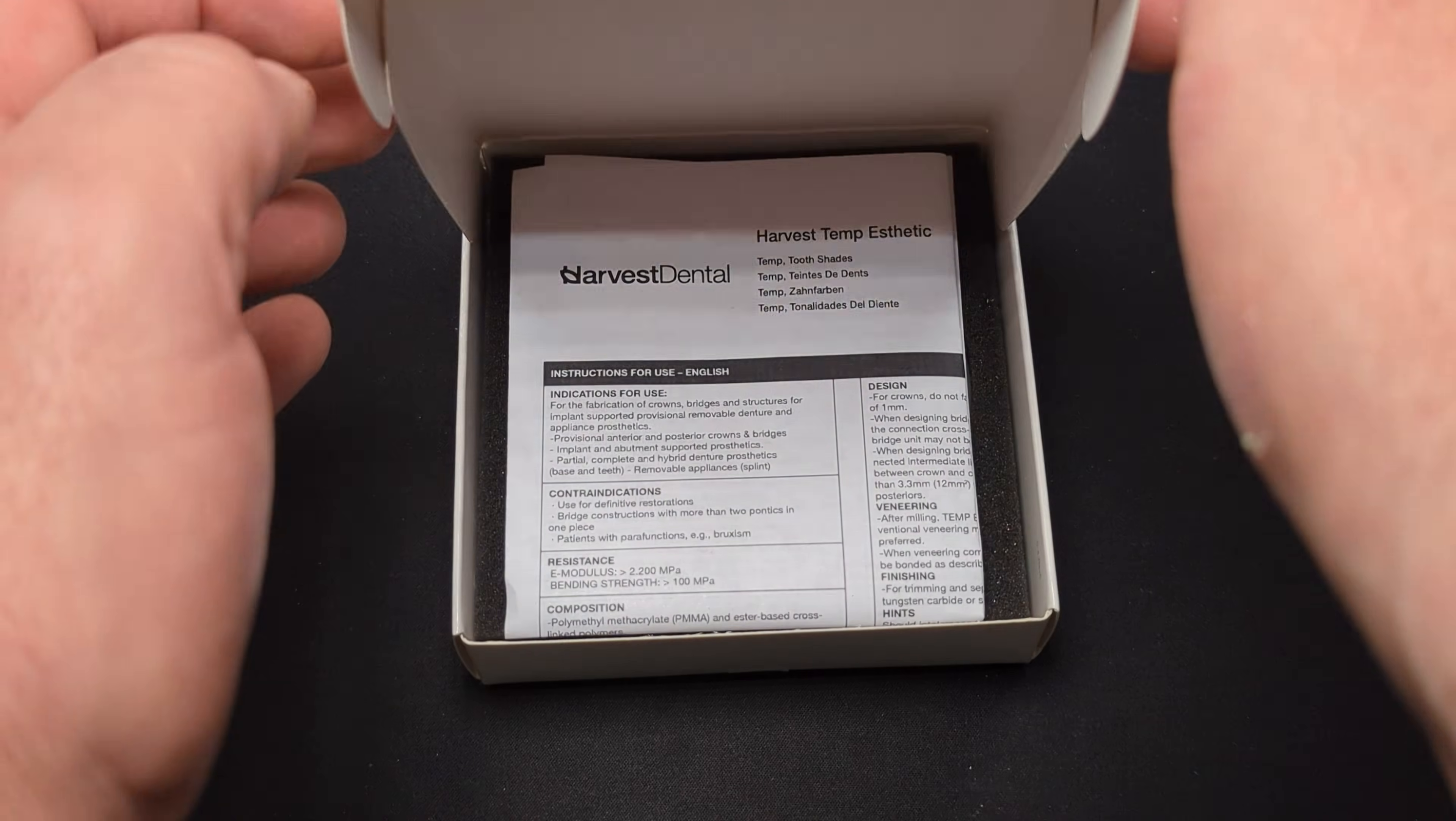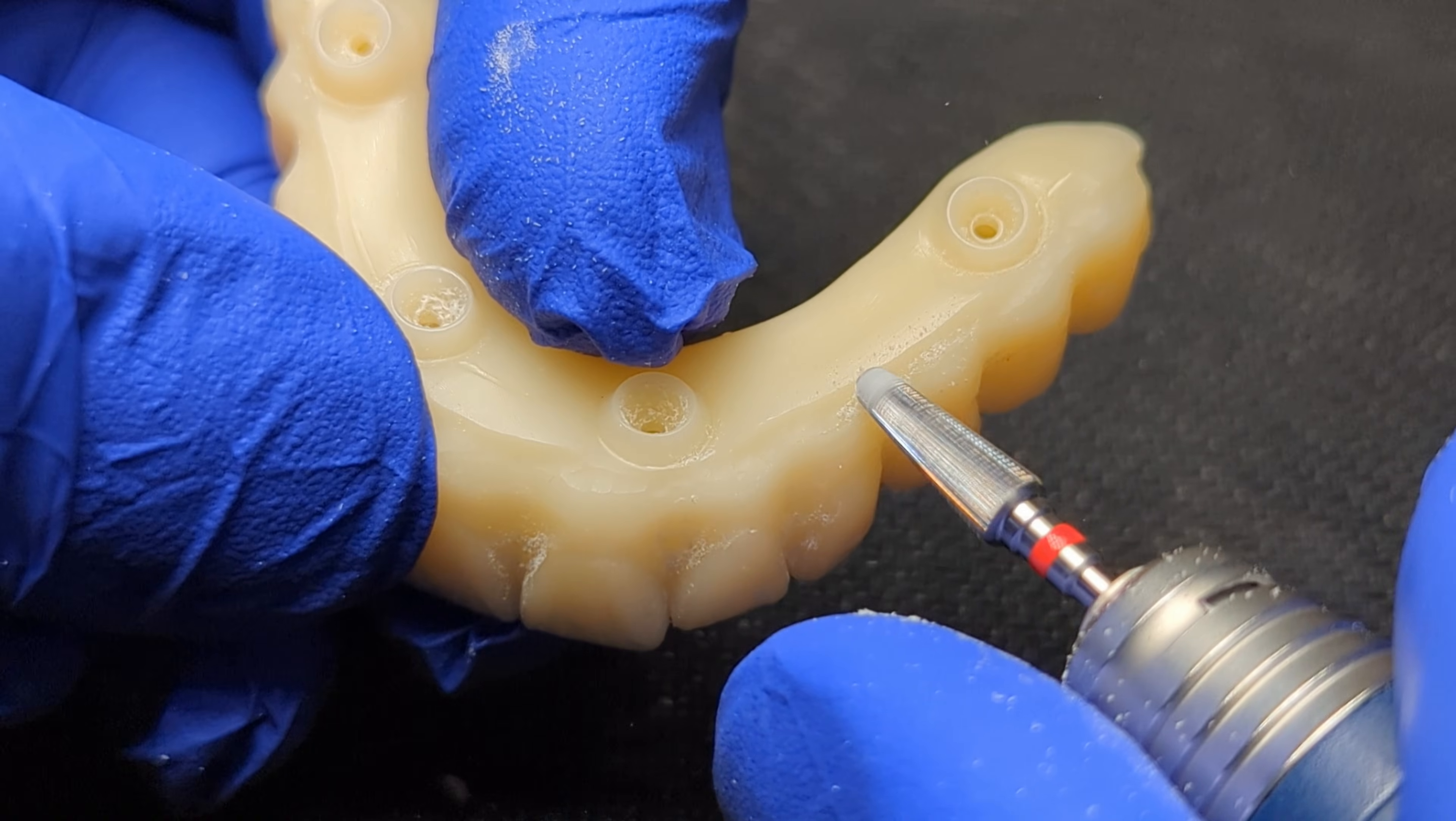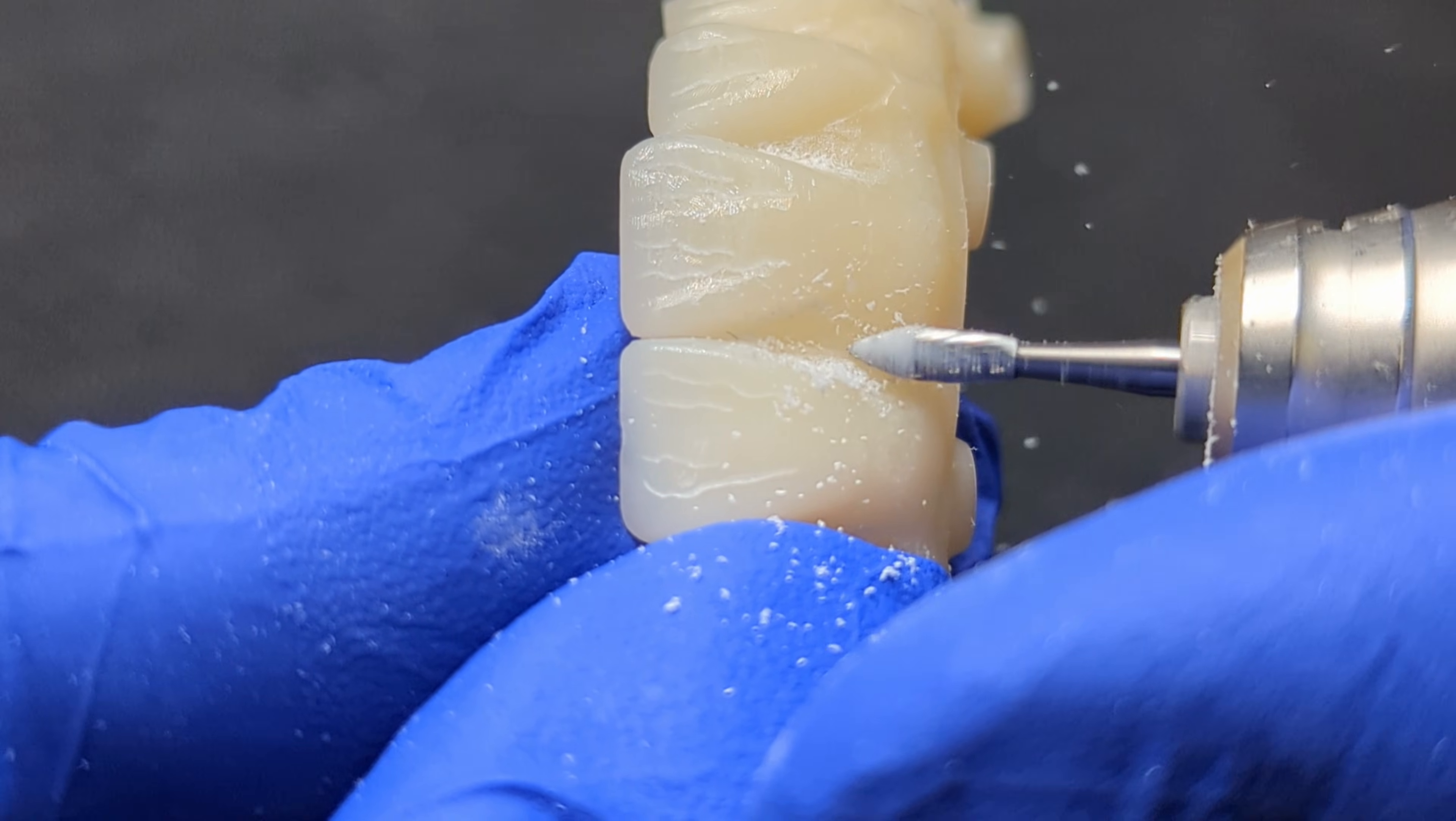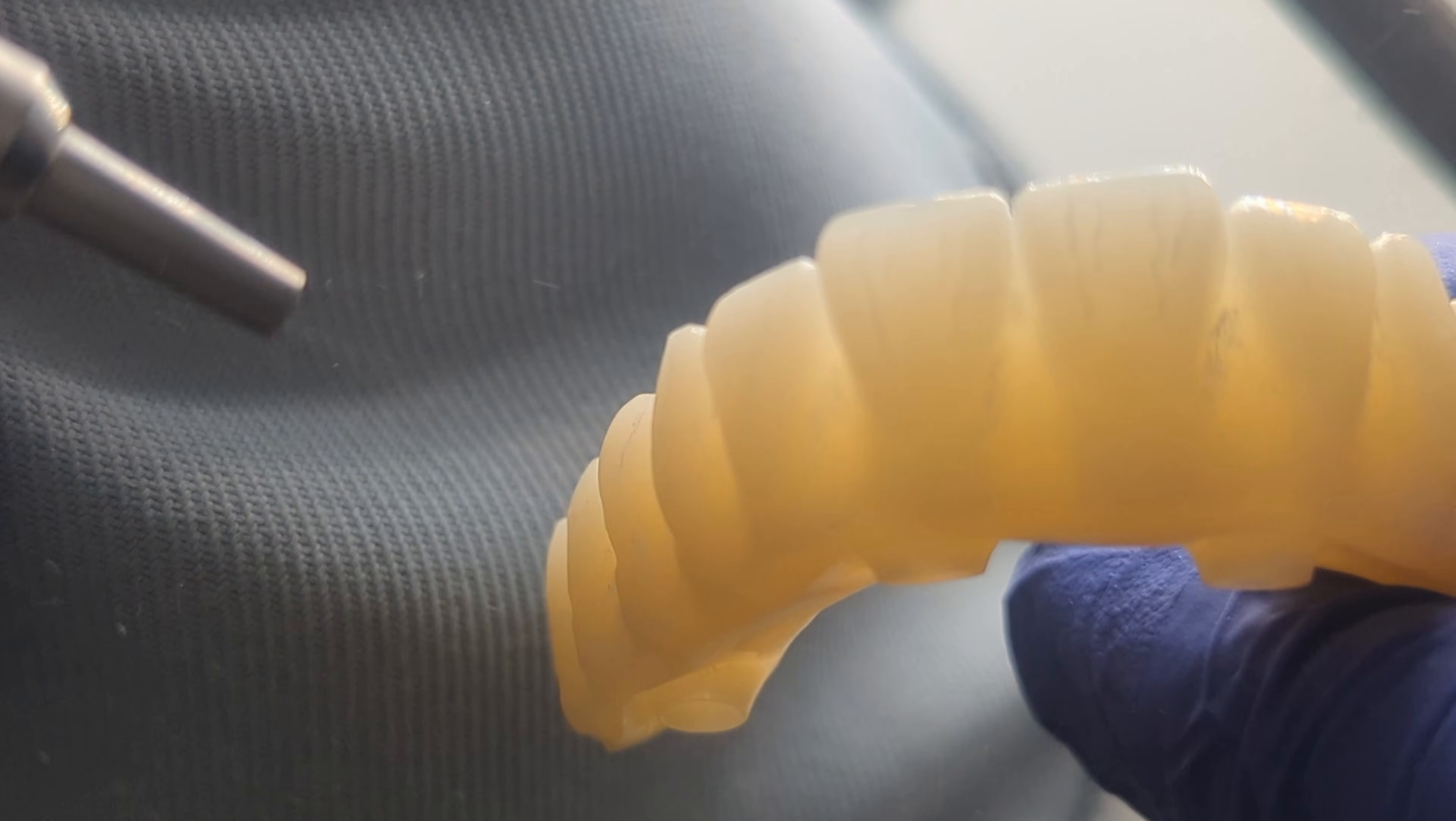The next step is optional. For a two-hour all-on-four, I could print the prosthesis, but I prefer the look and fit of the milled version. Using carbide burs, I prepare the PMMA for the PIC application. I open the embrasures and thin out the neck areas. I also sandblast the entire appliance with aluminum oxide.